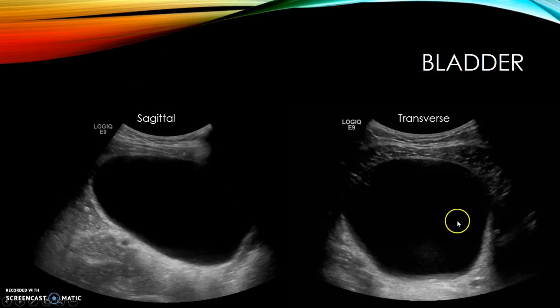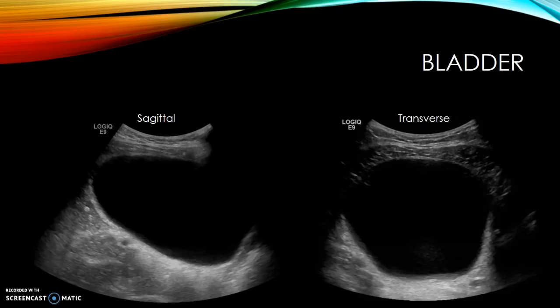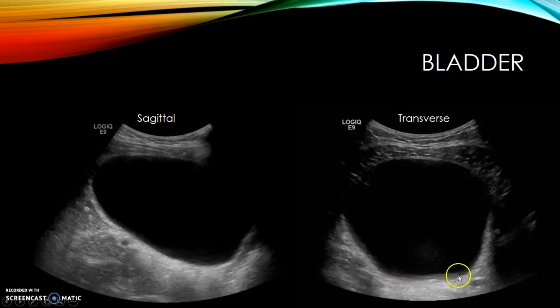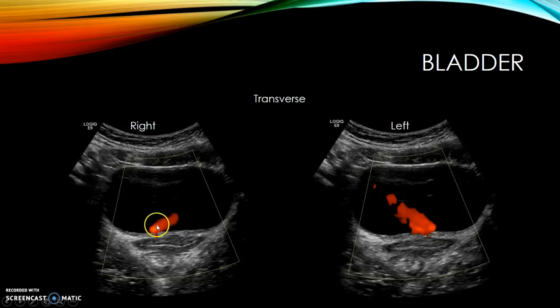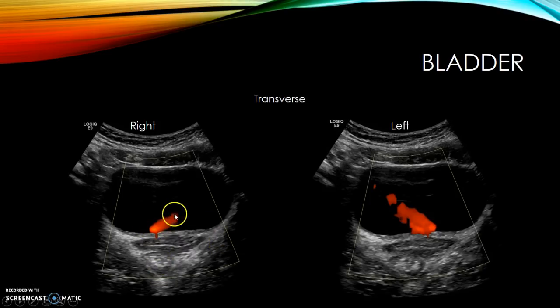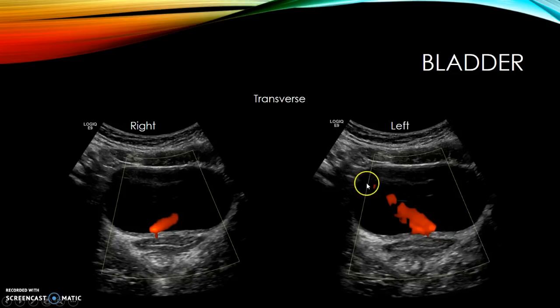For bladder scanning, begin in sagittal or transverse. In sagittal, take a midline view and check that the wall is thin and the bladder is adequately filled. Scan laterally to the right to see the right ureteral orifice and use Doppler to see the right ureteral jet; scan to the left for the left orifice and jet. In transverse, take superior, mid, and inferior views. With Doppler you'll see the jets entering the bladder — sometimes the streams cross, which is a normal configuration.